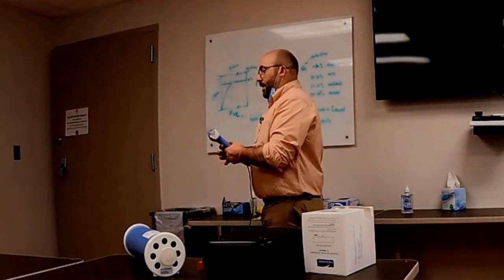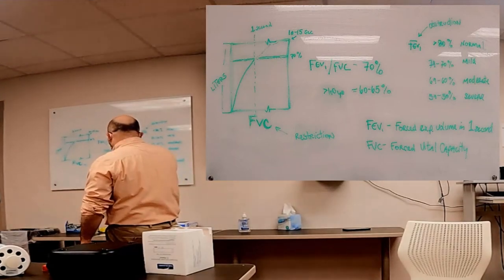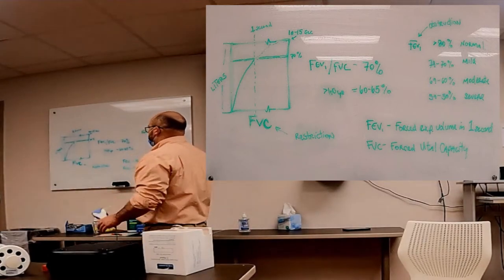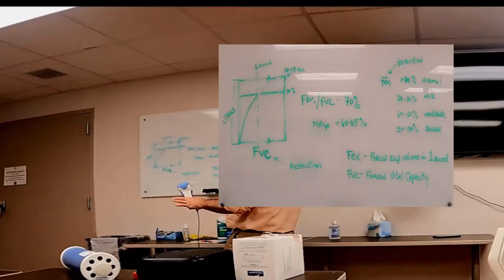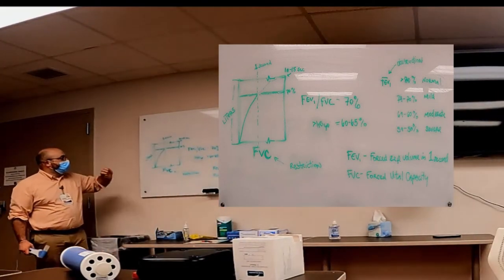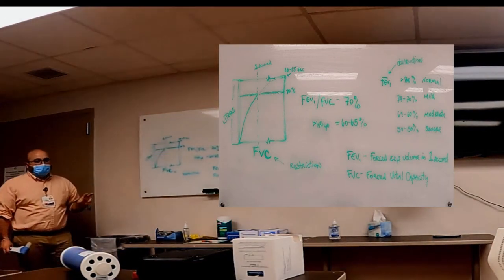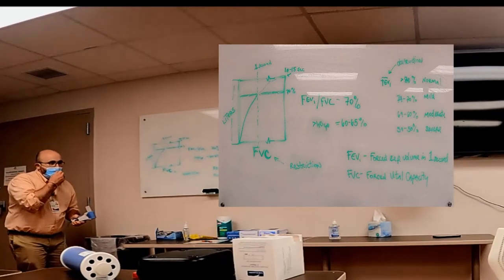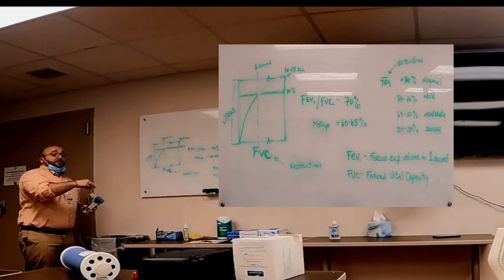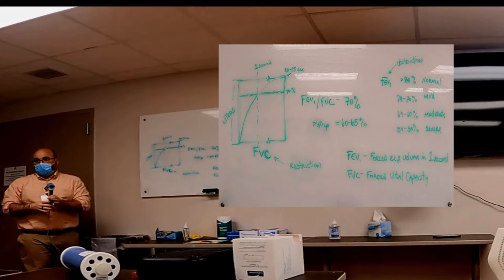So to do a forced vital capacity, we've got these two things we're gonna look at here: forced vital capacity and FEV1, forced expiratory volume in the first second. Let's make it super easy, because I have some pictures here. So let's say that, Chelsea, your forced vital capacity is this area right here. That's how much air you should be able to exhale by going all the way in, and then from this point all the way out till totally empty. Top end to the bottom, totally empty. That's forced vital capacity. That's the full amount.